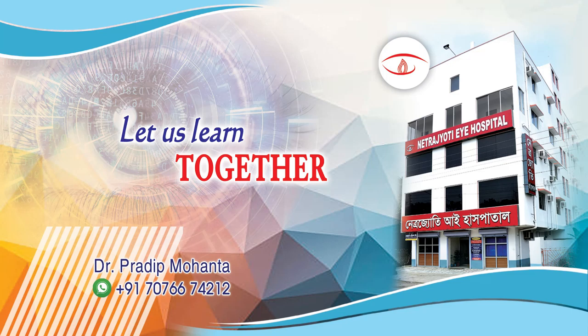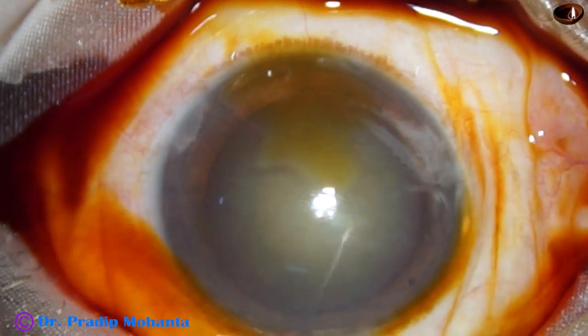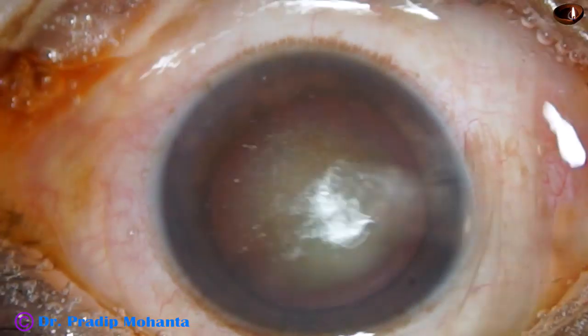Friends, welcome to my workplace at Rana Ghat, West Bengal, India. This is a totally unedited recording of phacoemulsification for cataract with grade 3 nuclear sclerosis.